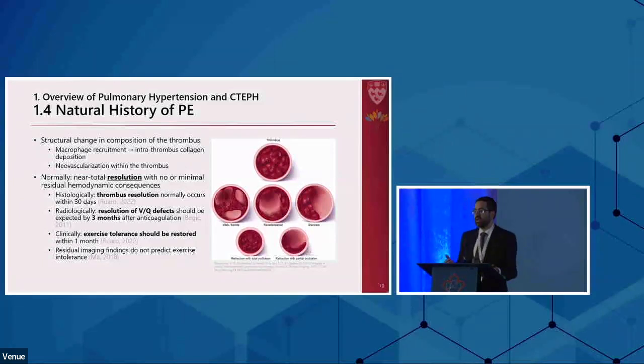And that's why it's important to get a baseline scan after 3 months, because when you're going to do follow-ups and there's a chance of recurrent PE, then if they come again, you're not going to be sure whether it's acute or chronic.